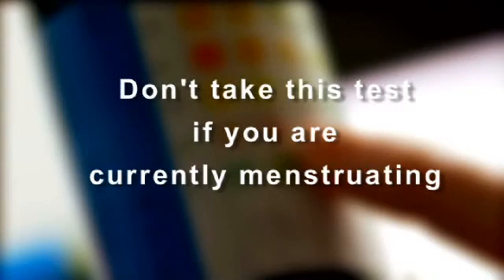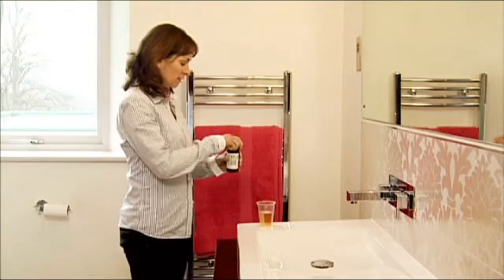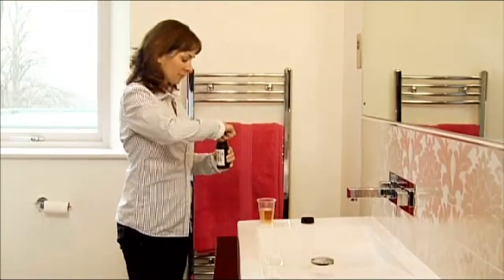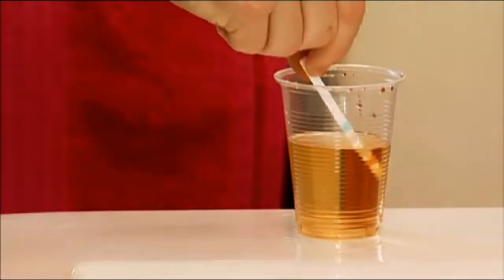Take a dipstick out of the jar, holding it by the white end. Take it to the bathroom along with a container to collect your urine sample — the disposable plastic cup is perfect for this test.